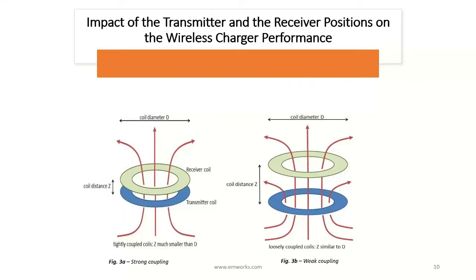So after having an idea about EMS for SOLIDWORKS, we can move on now to study our wireless charger system for a pacemaker. We are going to start by seeing the impact of the relative position of the charger coils. Both the transmitter and the receiver positions play an important role in the performance of any wireless power system, not only in this case, which is the implantable devices. It affects mainly the coupling coefficient, which also has a great impact on the receiver output voltage.